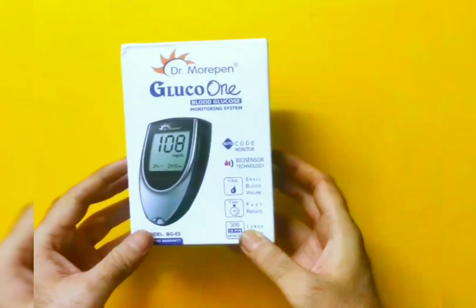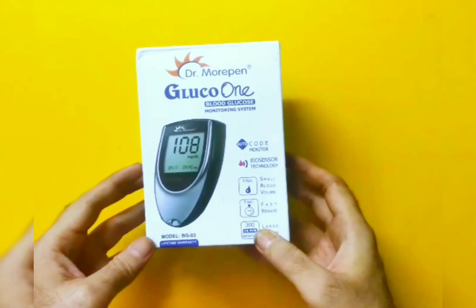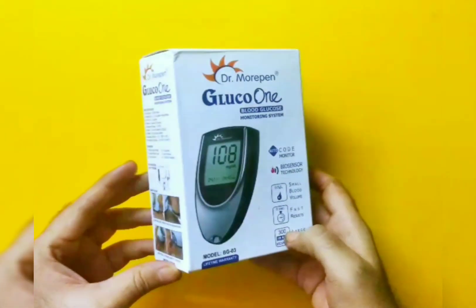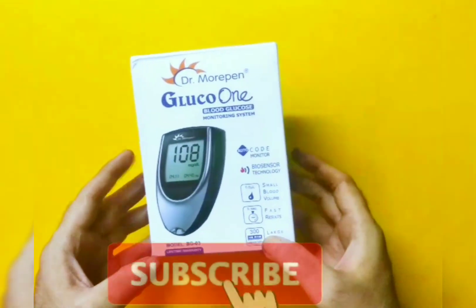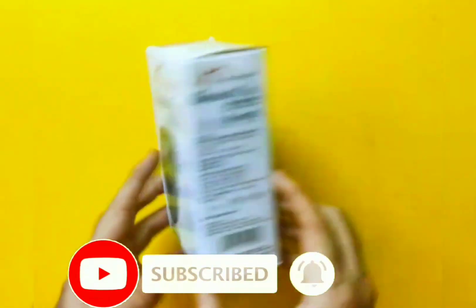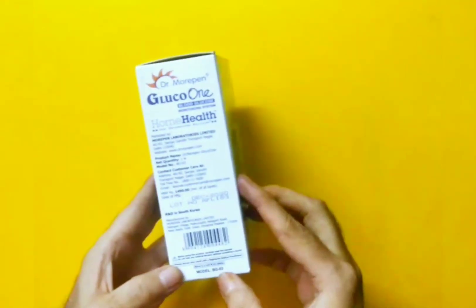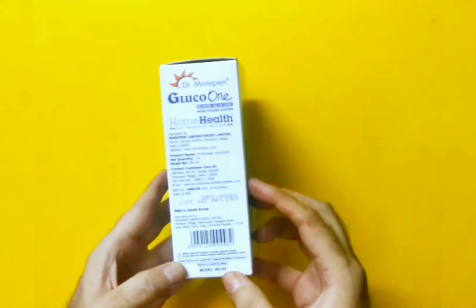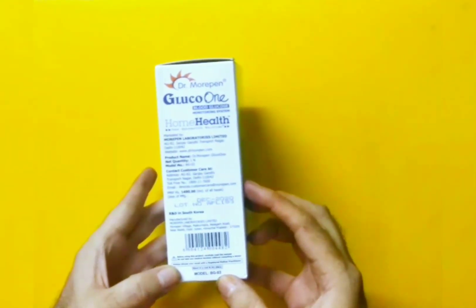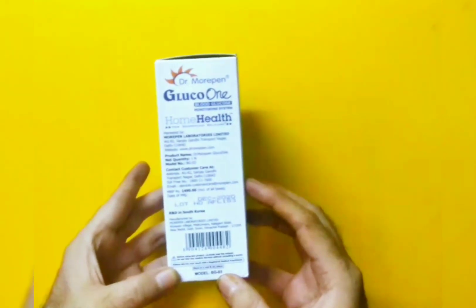Hello friends, today we will be doing an unboxing of this blood glucose monitoring system which we have bought. We'll also do a small test to check the sugar level. The MRP of the Gluco One model BG03 is 1490, but normally you will find good offers on different e-commerce sites like Amazon and Flipkart.